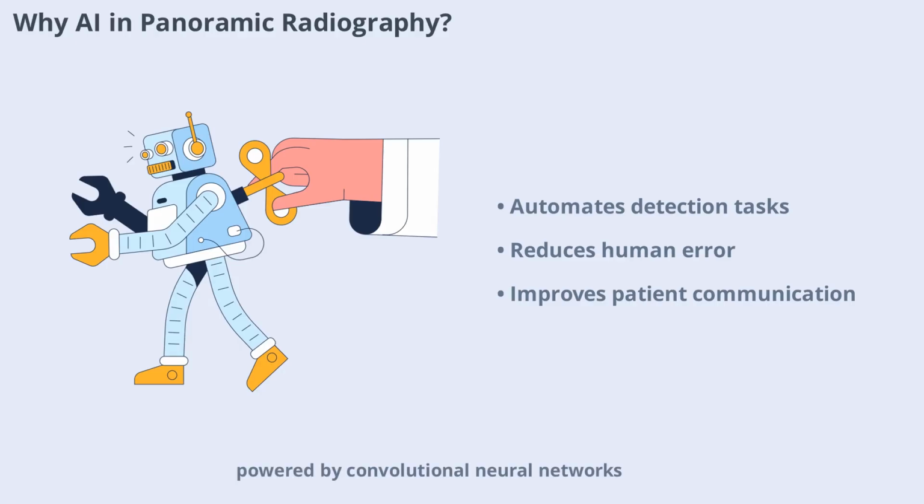AI, powered by convolutional neural networks, offers a solution by automating object detection, tooth numbering, microspatial measurements, and early pathology identification. AI's ability to overlay color-coded findings on radiographs enhances patient communication and acceptance, transforming subjective recommendations into evidence-based decisions.